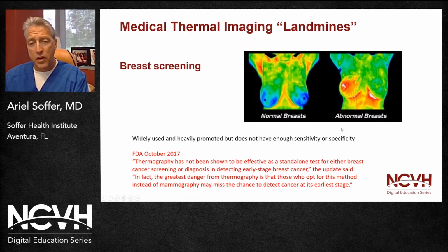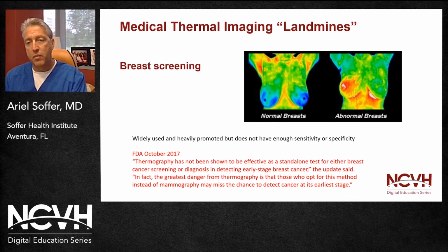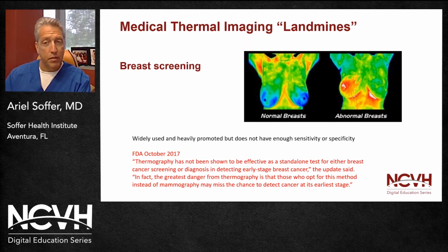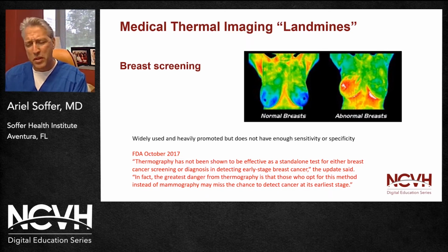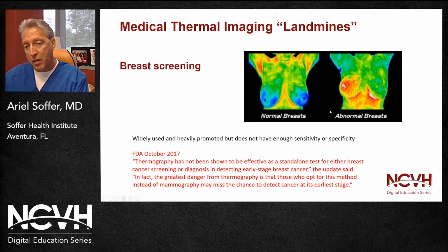It got a lot of early use, but did not have the sensitivity and specificity to be a great test, because breast tissue is by definition tissue, and there can be a lot of it, and that can make the emissivity a problem, and therefore there can be false negatives, and you really can't have that when you're detecting something like cancer. So the FDA made a decision in 2017, after seeing a lot more of this and growth in the industry, that this was not probably something that we should be using alone, but we can use it adjunctively with more common breast imaging techniques such as mammography and so forth.